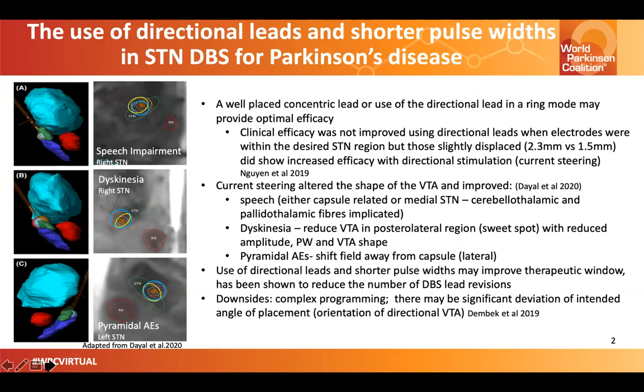The downsides, however, are that the programming might become complex. And there has been evidence that there may be significant deviation of the intended angle of placement of the directional lead, which will change the orientation of the directional VTA. However, when we're able to visualize leads and the orientation of the lead on the physician tablet, this might greatly improve this.